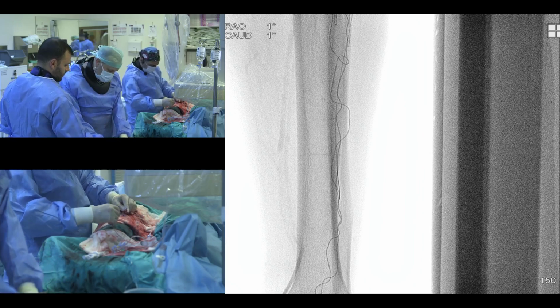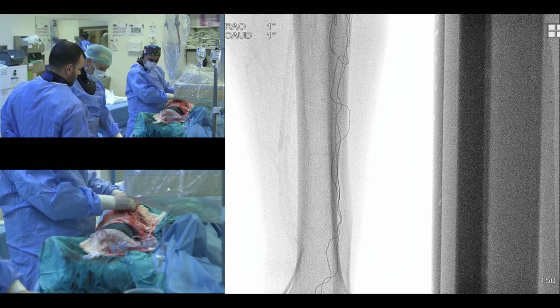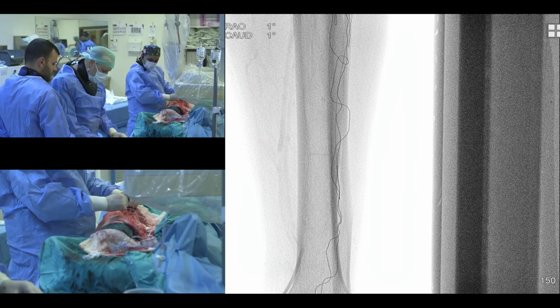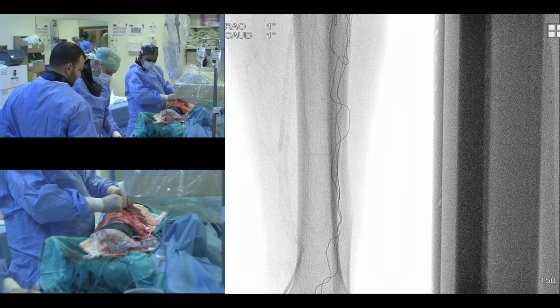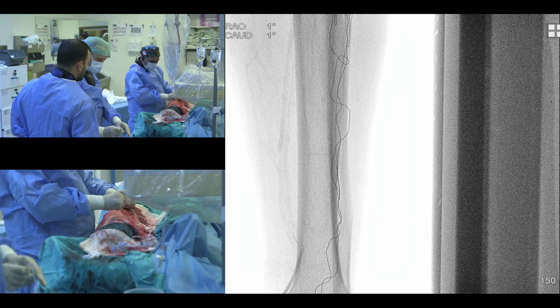You saw the findings. We did kissing balloon angioplasty of the ostium of the posterior tibial and peroneal. We used a Hawk-1 atherectomy device for the distal popliteal, TP trunk, and the ostium of the peroneal artery. We used a chocolate balloon, 4 millimeter by 40, for the TP trunk and the distal popliteal artery. And a 5 millimeter by 120 chocolate balloon was used for the popliteal. And finally, the popliteal artery was treated with a drug-coated balloon. So this was done in July 2022.